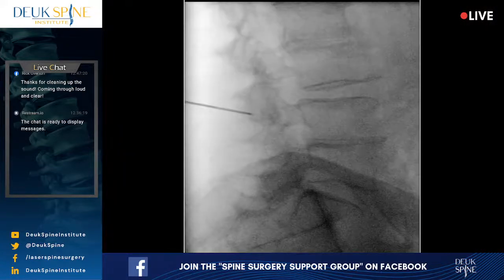All right, that's fine. So you can see on the x-ray that there's the sacrum at the bottom. You want to point to the sacrum for us, Jordan? Sacrum is the tailbone, and then the first disc there above the sacrum is the L5-S1 disc, and then show us the L5 vertebral body. And now take a look at the L4-5.